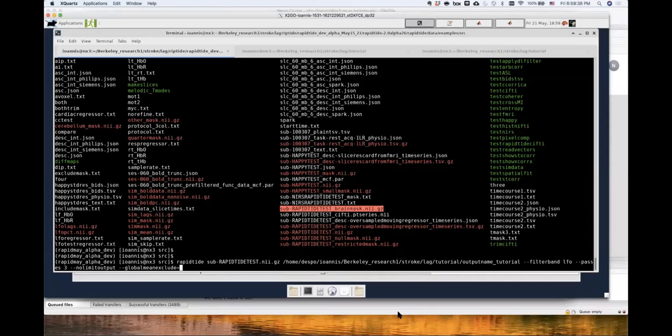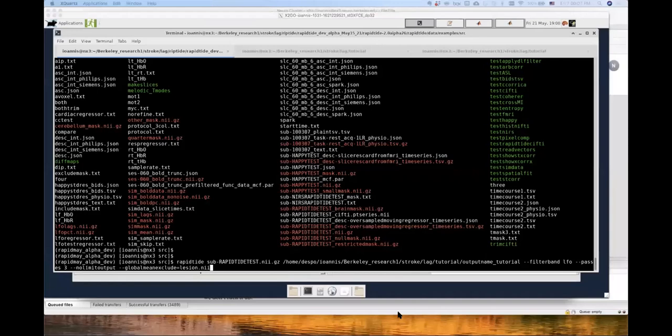This option tells rapidtide to not take into consideration voxels that are within that mask. Now, why is that useful? For example, in my lesion studies, I usually use this option with my lesion mask as input. So for example, I can have a lesion file right here. Thus, I'm restricting rapidtide from taking into consideration the lesion signals that can potentially contaminate my regressor.